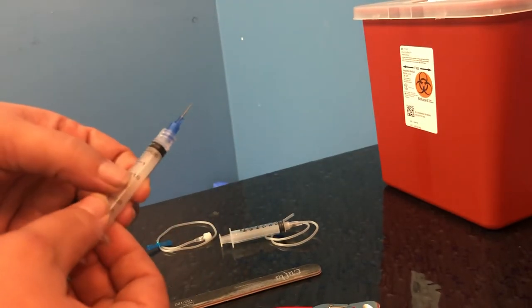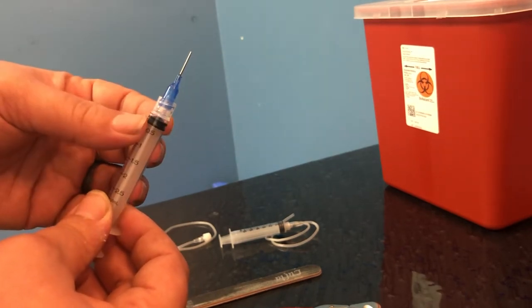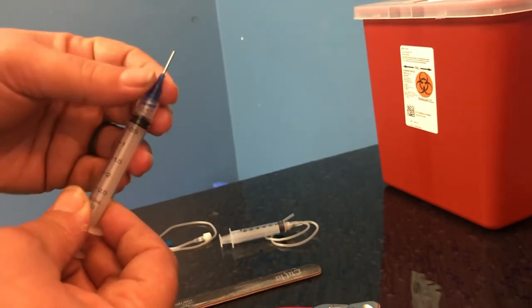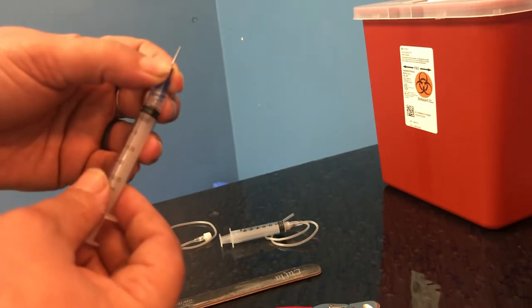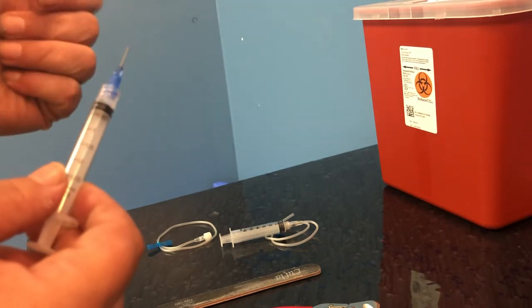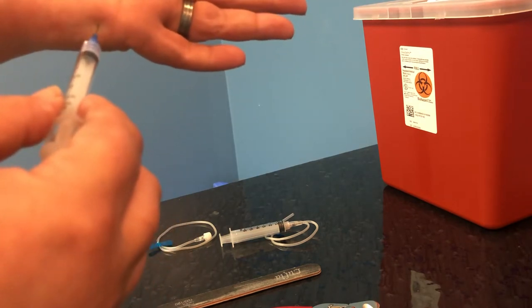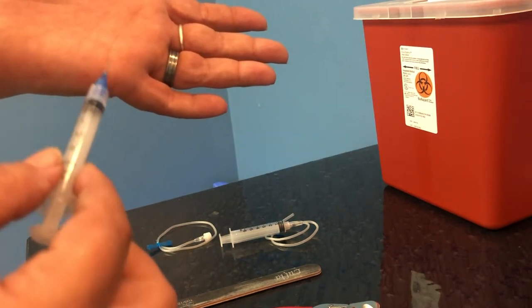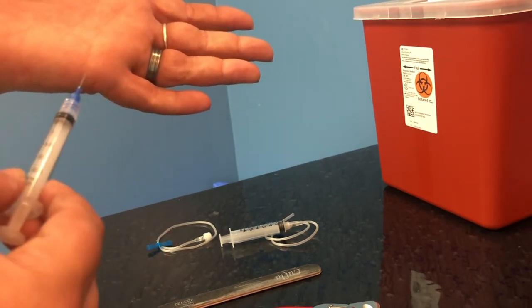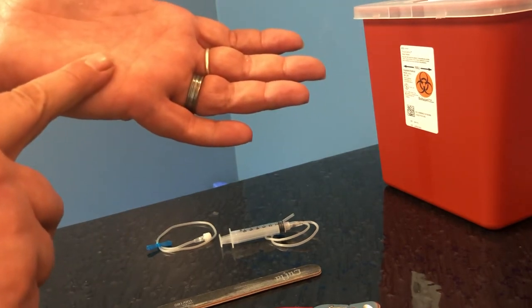When I am using these, I can also use larger gauge ones where the size of the needle is wider, and that's gonna be a more blunt stimulus, okay? Or I can use fine gauge, this is 22. I can go all the way down to a 25. The smaller the tip size, the more intense the stimulation. Just like a high-heeled shoe, when we step on something, it'll sink right in compared to a flat shoe. Anytime we have a smaller surface area, that is gonna be a more intense amount of stimulation that is going to be sensed by the animal compared to a wider surface area stimulus like a fingertip.